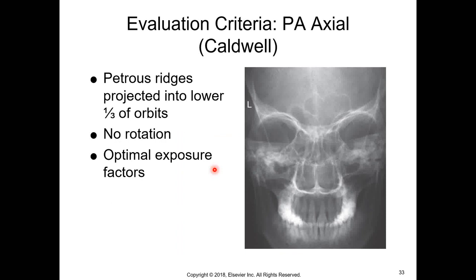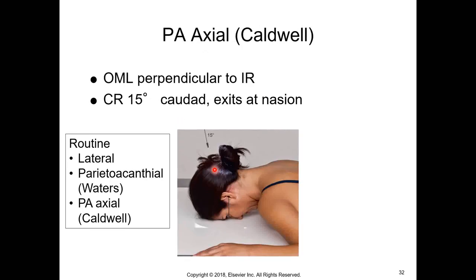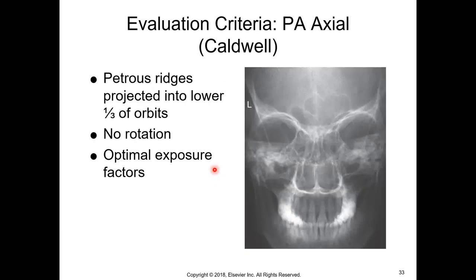I'm sorry, I lied. When it's a 15-degree angle, my apologies, it's going to be in the lower third of your orbits. Let me just repeat that. It's going to be in the lower third of your orbits. I'm sorry, it's a 0-degree angle when they're filling the orbits.